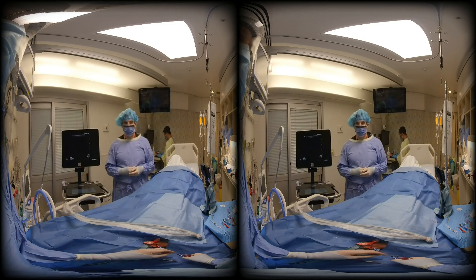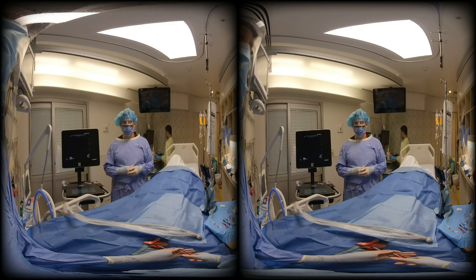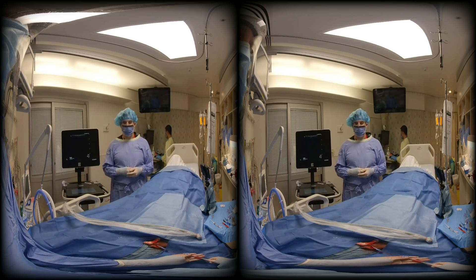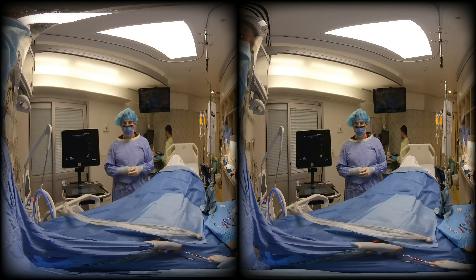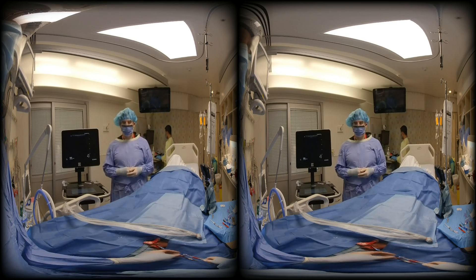Once you have flushed each line, you can then secure the central line to the patient's skin on either side of the device. Be mindful that you have infiltrated a large enough area so that this process should be relatively painless.